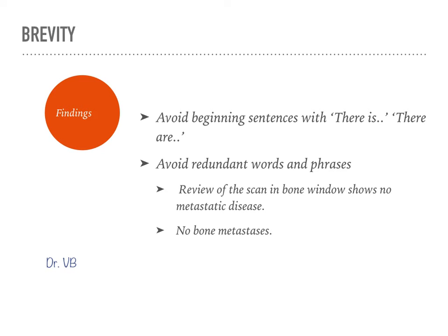Avoid beginning sentences with "there is" or "there are." So if you have a focal lesion, there's no need to start with "there is a focal well-defined lesion in segment 6 of liver." Rather, you can straight away go with "a well-defined focal liver lesion in segment 6 of liver." Avoid redundant words and phrases.